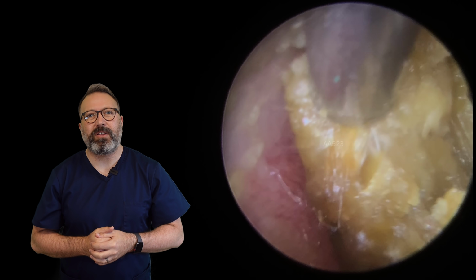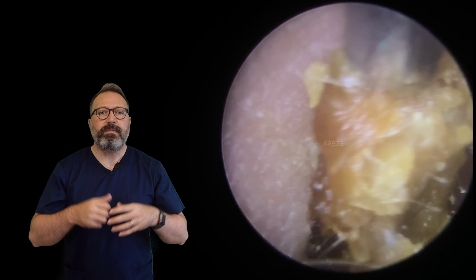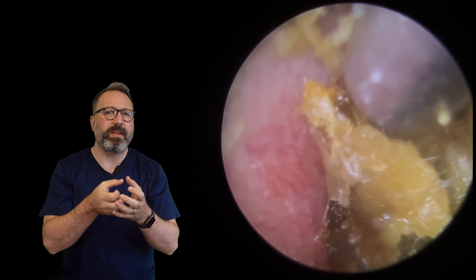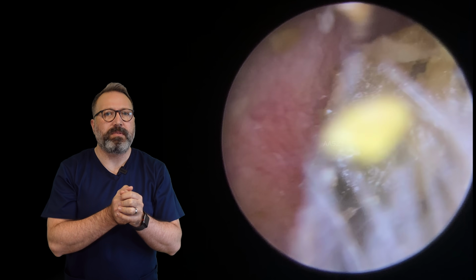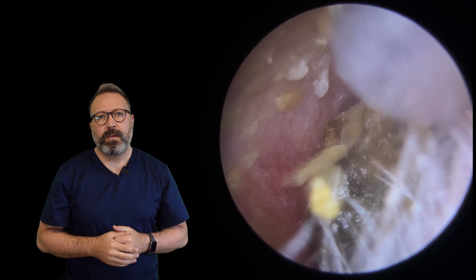We've got it. Oh, we see we've got a little bit of movement. That's a big piece starting to loosen off. There we go. The difficulty you have when you have these plugs that have a lot of skin in them is they do tend to bind together really well. This looks like a little flap of skin there. There we are, just to the one side. So let's get rid of that. Out that goes. Now you'll start to see a much darker material here further in.